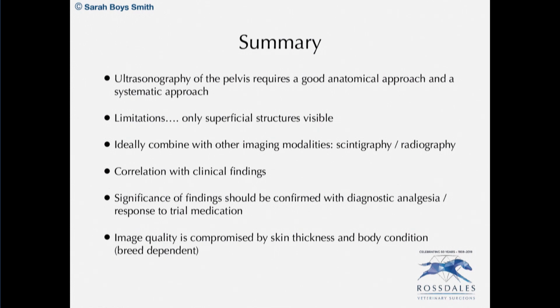and our clinical examination. And as I alluded to, the image quality is massively affected by breed. So big warmbloods, etc., are not, unfortunately, as rewarding as our thoroughbreds.